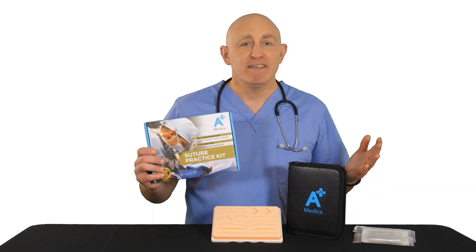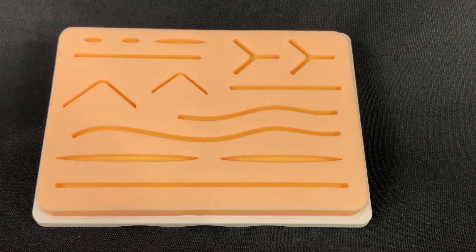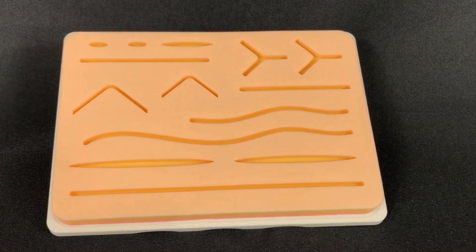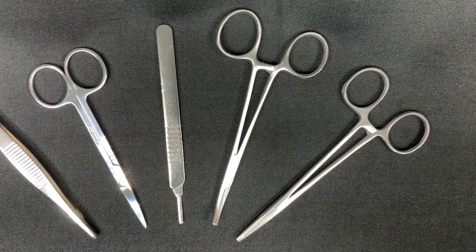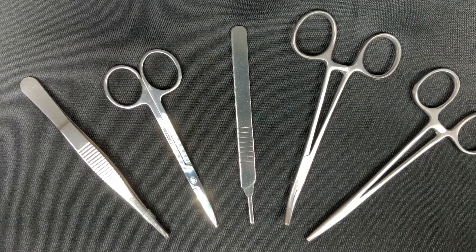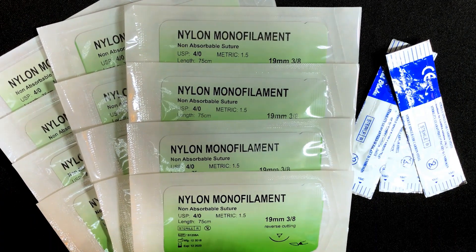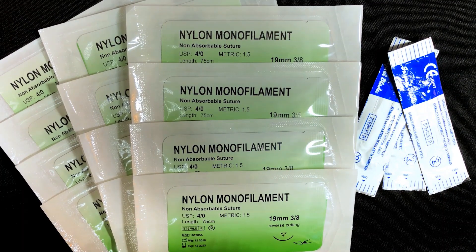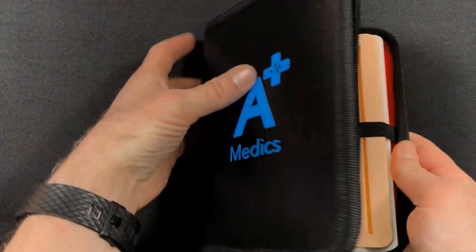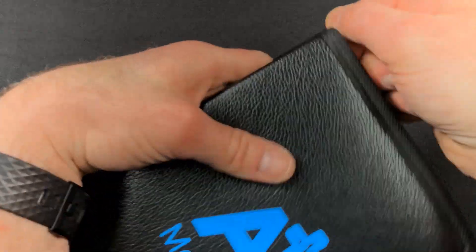Unlike others, our kit comes with the following: a skin-like pad with a strong, non-slip base to prevent sliding or movement while suturing; a robust, five-piece stainless steel tool set; suture threads and blades for creating custom cuts on the pad; and a new carry-all leather case to carry everything with you, anywhere, at any time.